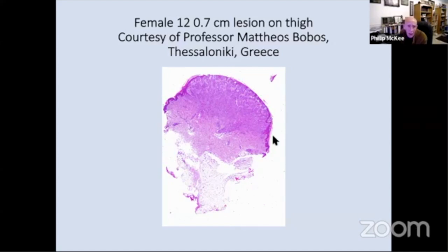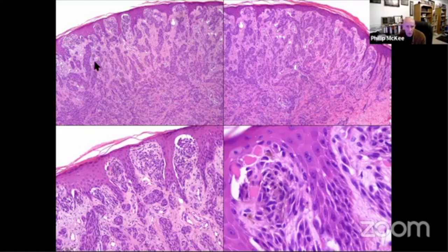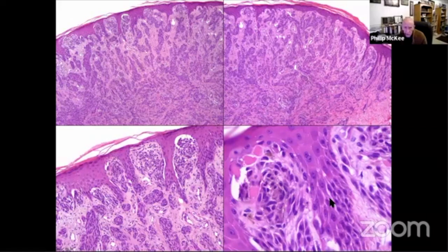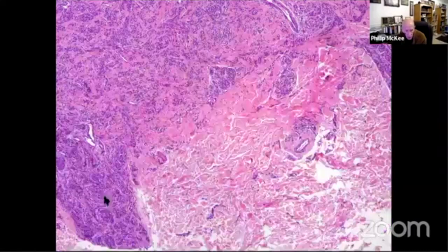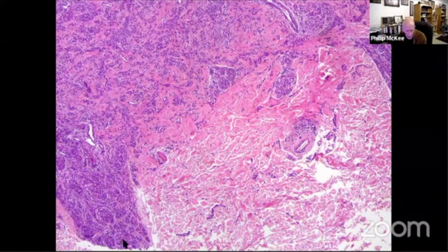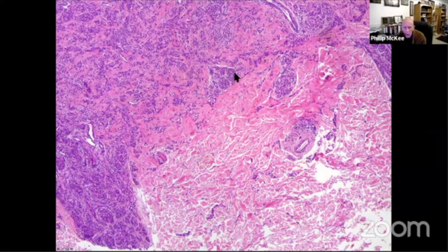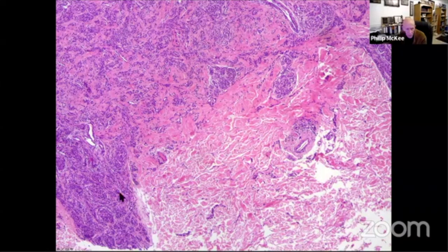Looking at this in close-up, this picture highlights the spitzoid appearance with the retraction artifact, the conspicuous Kamino bodies, and this fascicular or plexiform growth pattern. There's an extension going along a neurovascular bundle or something — I'm not sure we can regard that necessarily as reflecting the deep margin, although it might be. But there are nests at the deep margin that are relatively large compared to the ones above it, suggesting that maturation is not all that it might have been. I was a bit uncertain about it, to be honest.